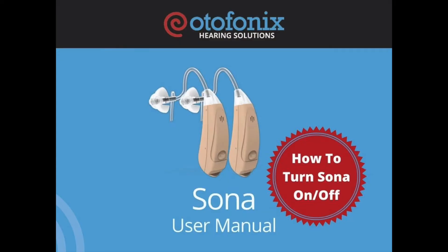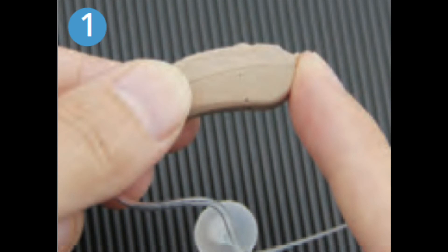How to Power Your Hearing Aid On or Off. Step 1: To power on, gently insert the battery and close the door.